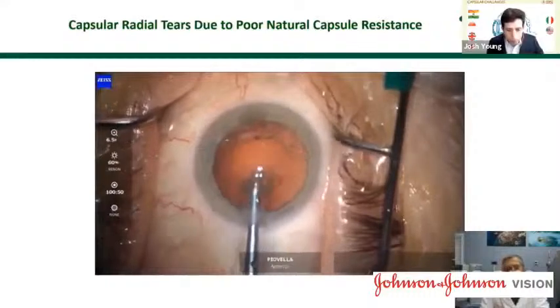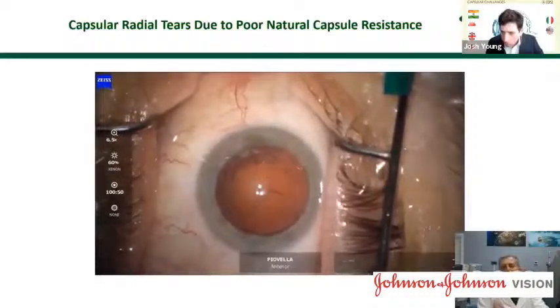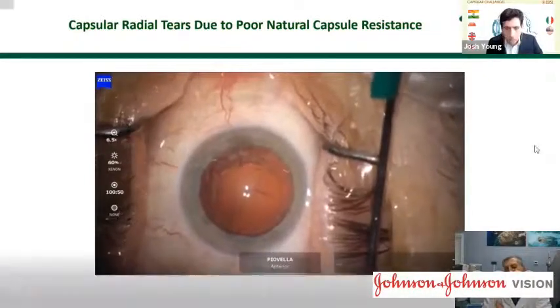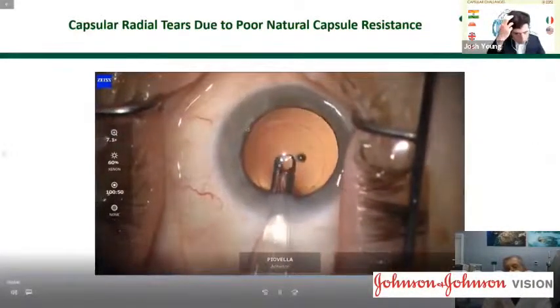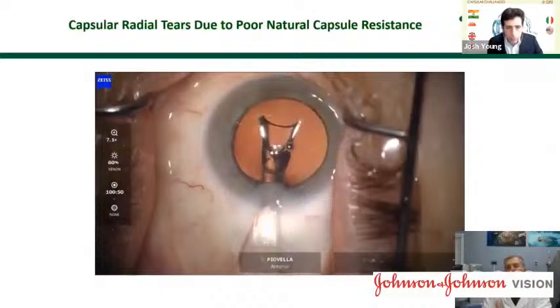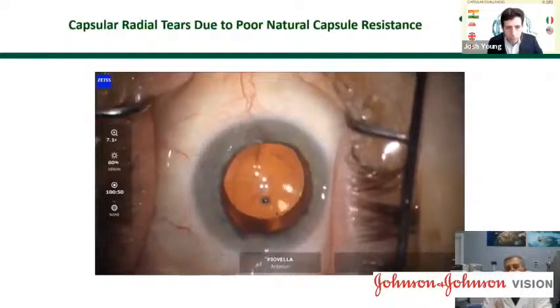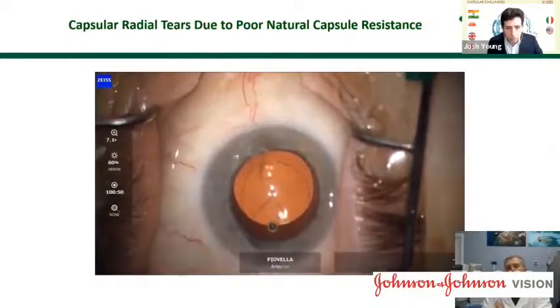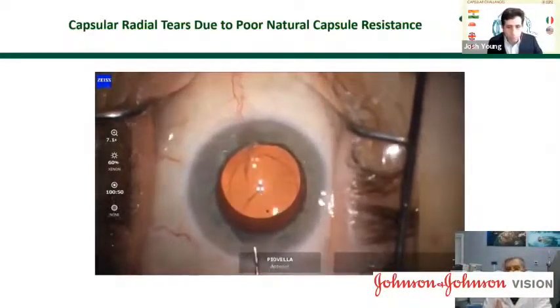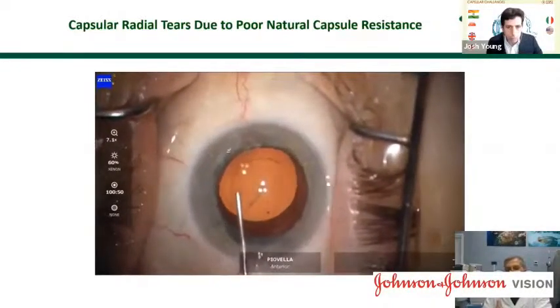So that is after the takeoff, and that is the point at which I have provided an anterior opening of the anterior capsule, and one more time, I provide a perfect cleaning with a lot of attention. But one more time, it is mandatory to implant the IOL in the sulcus, over the bag, and then provide side-by-side positioning of the IOL inside the bag, and that is what is necessary.